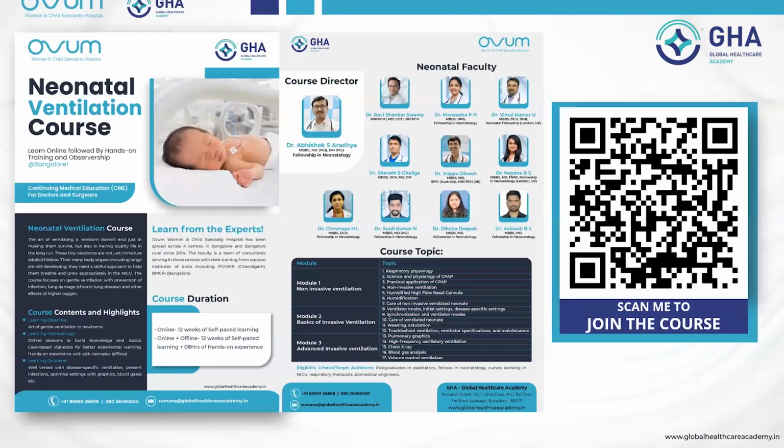It has to become dry. It has to be clean. The circuit has to be clean and dry before you go for ETO. Cleaning is a mandatory thing. You can't use the same circuit for every baby. You will transmit infections. So if you follow all the rules, maybe 1 or 2 babies you may use and then prevent reuse. But I'm telling you that we are not resource poor.